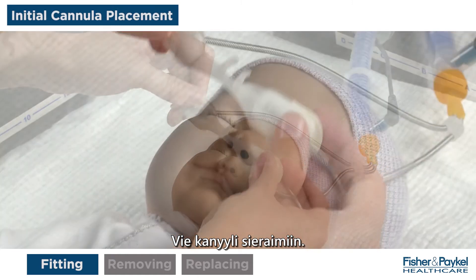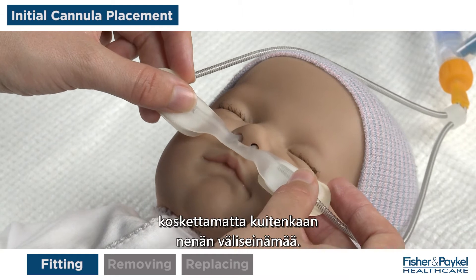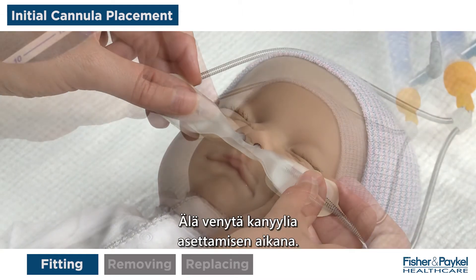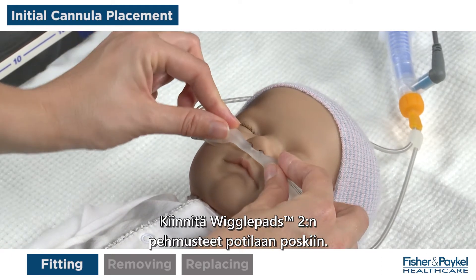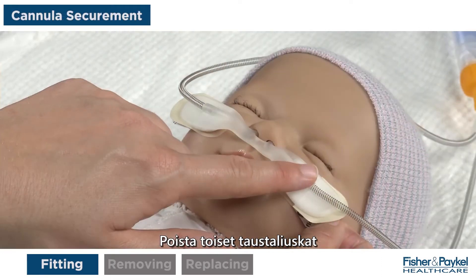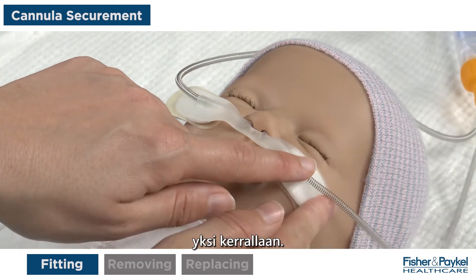Remove the first backing tabs from the wiggle pads and avoid touching the adhesive. Keep the second backing tabs in place. Insert the cannula into the nares. Ensure the cannula bridge rests close to the nose without touching the septum. Do not stretch the cannula during application. Stick the wiggle pads to the patient's cheeks. Remove the second backing tabs and stick the wiggle pads onto the cheeks one at a time.